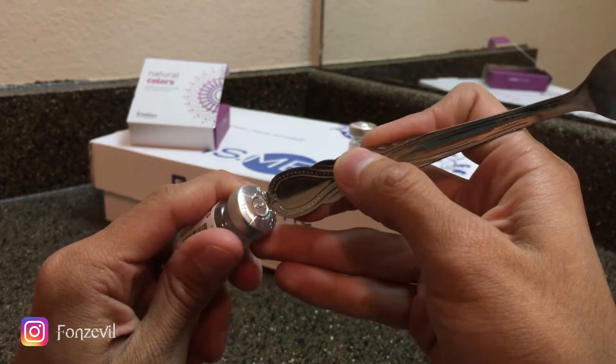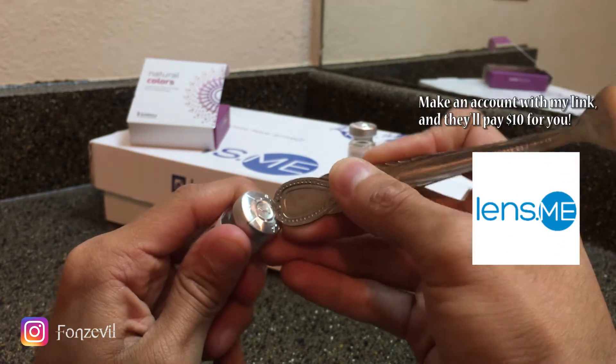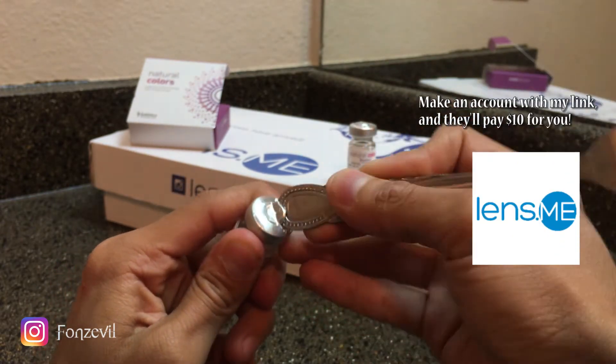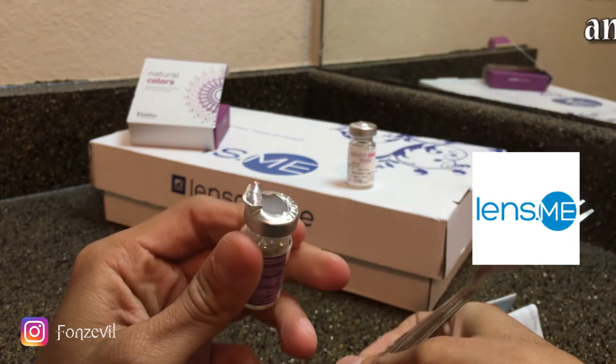So what I do — let me see if I can get that in focus — you guys are going to want to put pressure and then just kind of open it like a soda can. So there you go, it's going to look like this.